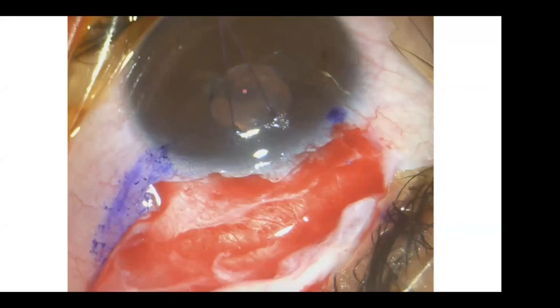Alternatively, we can place a corneal traction suture, which I think most of my colleagues and myself are doing nowadays. A corneal traction suture is applied to the superior cornea, sometimes to the inferior cornea. This is the one used nowadays: 7/0 Vicryl on a spatulated needle. You can see the marks because before the operation, I do the marks. Why do I do that? Because sometimes the eye rotates and then you are confused about where the lateral rectus is from the inferior rectus. Believe me, that could happen.